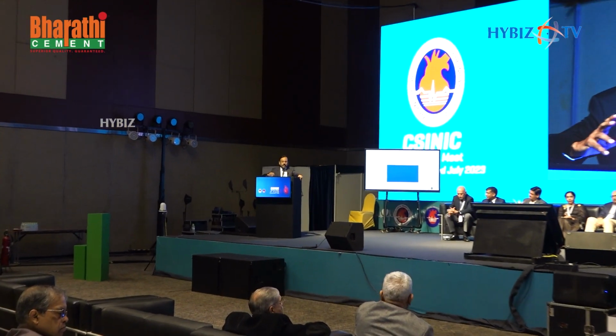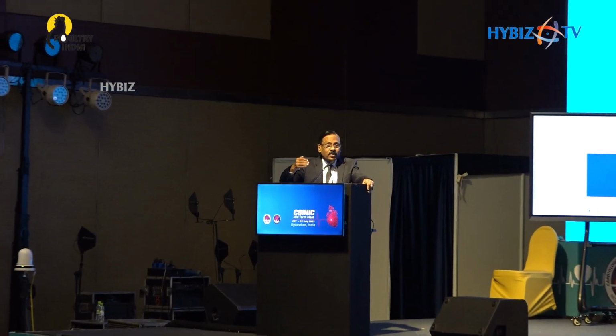Well, I think that is again an area where we can't give a definite answer. I told you that we have post-PCI physiology done by the pullback tracings and the FFR. And then on top of that, the IVUS analysis has been done. And they found that in the case of IVUS usage in that particular situation, a number of times you have to optimize.